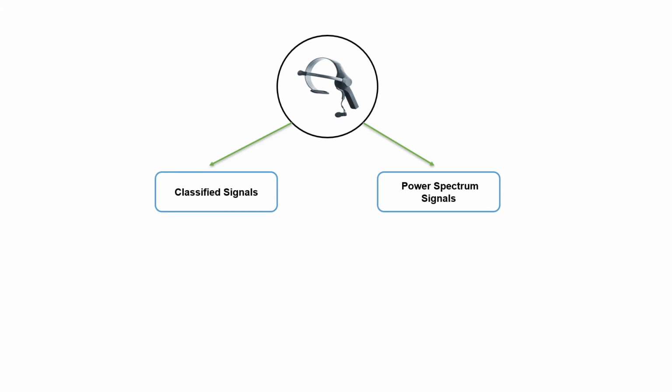Talking about our work so far, we have designed a code which takes classified signals such as attention, eye blinks to increase, decrease, start or stop our wheelchair. Specifically with attention signals, our user is able to control the speed of the wheelchair. We get attention signals that ranges from 0 to 128 from the NeuroSky headset. We take 50% value of this signal, which is 64, to set as threshold to increase the speed of the wheelchair by 1 unit. Then we take 75% value of this signal, which is 96, to set the threshold to increase the speed of the wheelchair by 2 units.